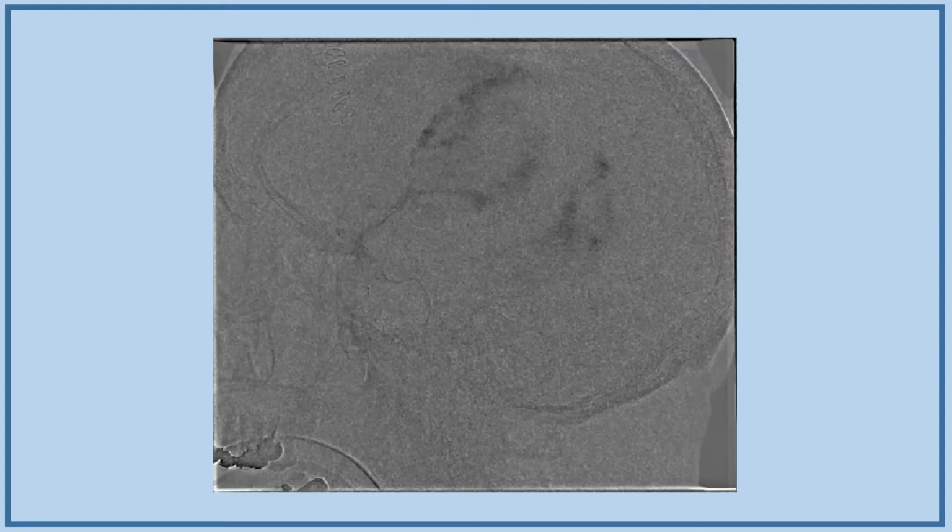Okay, so what do we do? We go into the petrosquamosal branch, far enough that we're kind of at the table of the skull, so we're past any facial nerve business. We inject some particles in this particular case. After that, we go to the frontoparietal branch. And so here's some particle embolization. You see that typical small particle embolization with contrast stasis in the embolized area.